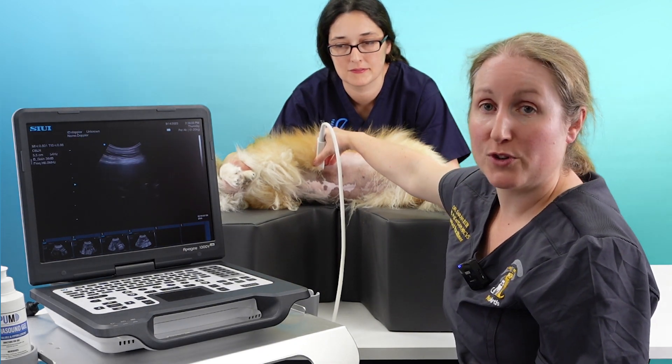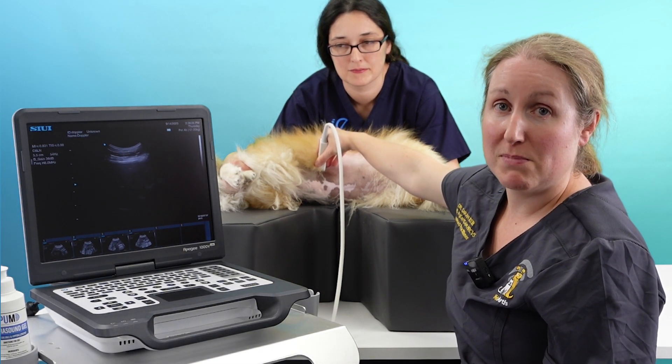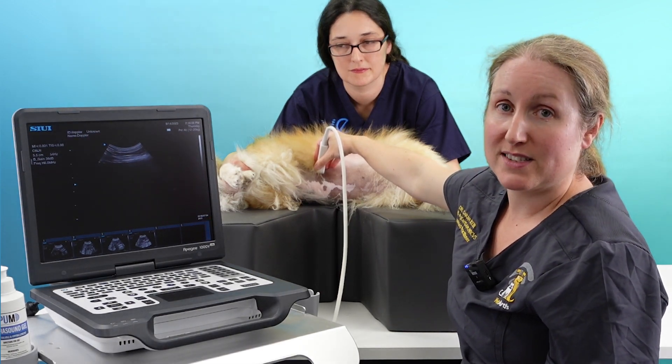By viewing the whole organ, we know we haven't missed anything that might be hiding, and we've assessed everything.